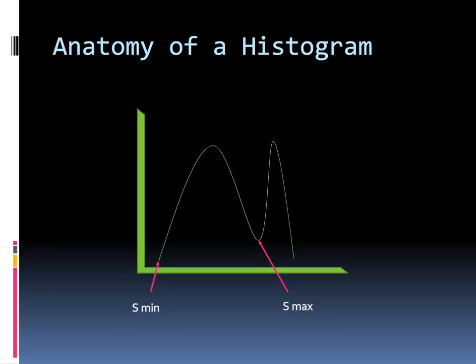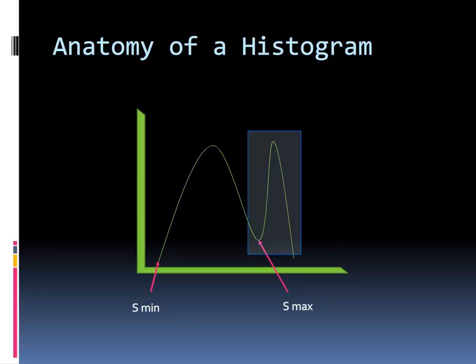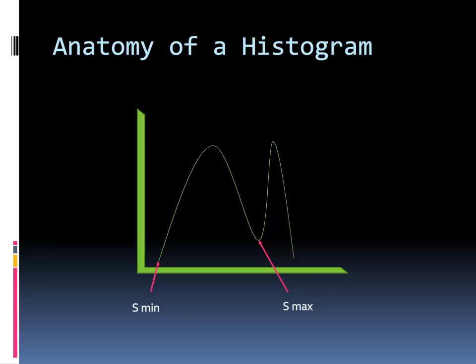For example, we see a spike to the right. This is representing values where the X-ray directly interacted with the image receptor and did not contribute to the valuable information of the VOI, and therefore they are excluded when calculating the EI. There are 3 types of histograms that we will look at. There's a type for different expected exposure configurations.